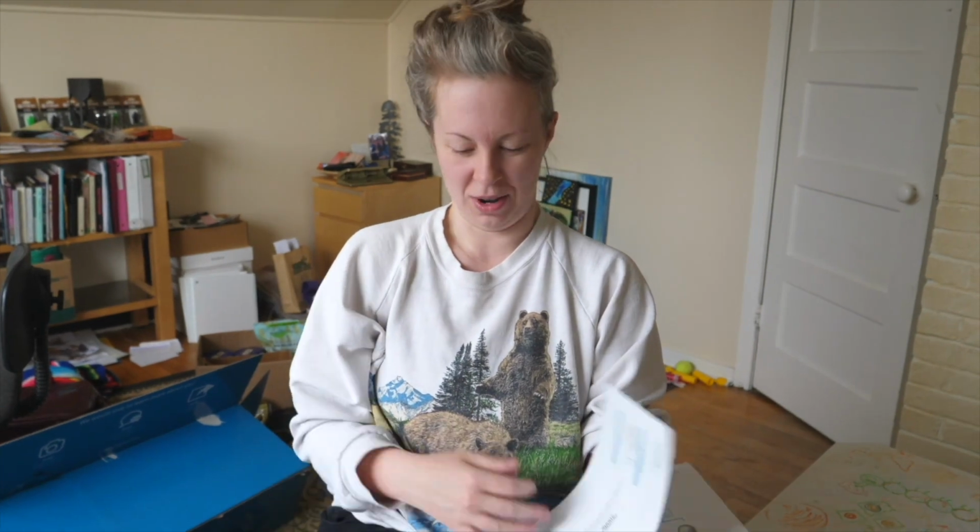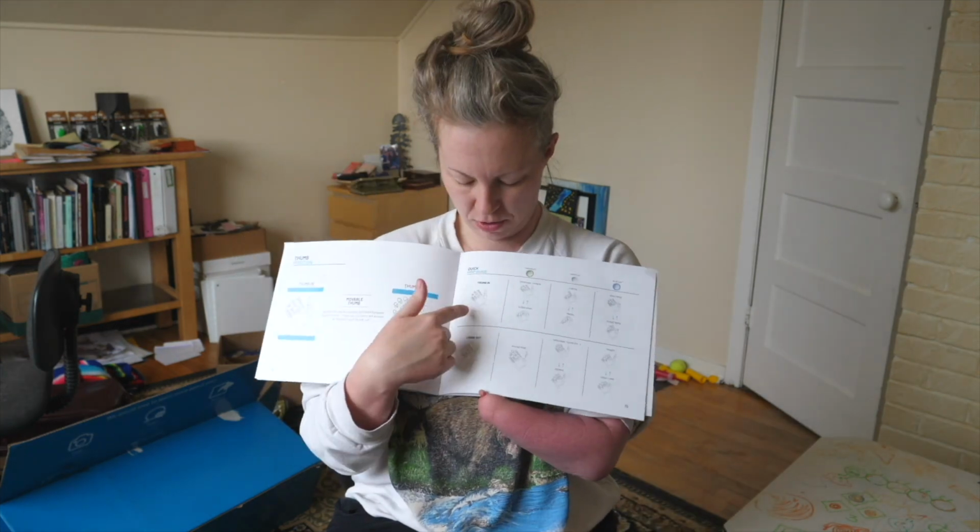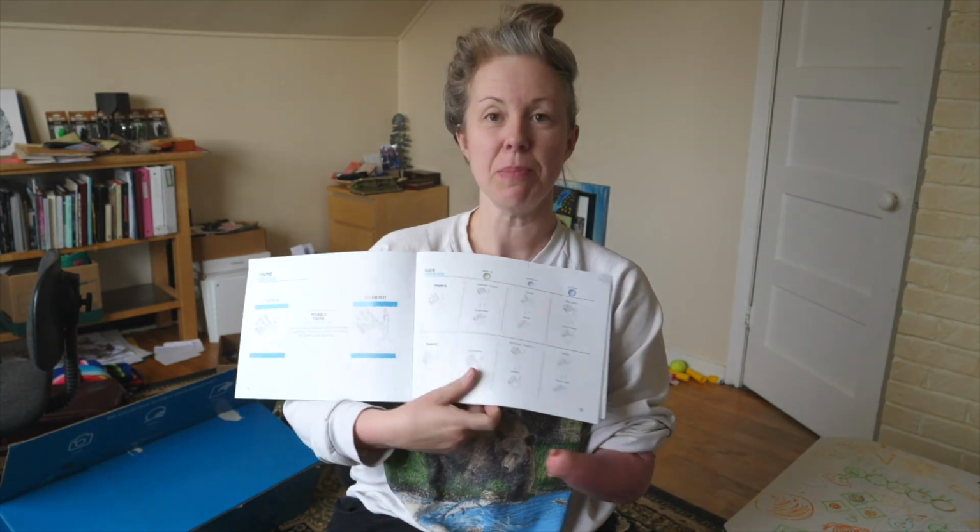So front and side. Whoa! Then there's like a thumb situation. So you can have the thumb pointing in like this, so it can do this, and then you can have the thumb going out. And then there's different instructions for what you do for each grip, and I have to learn them. I think it's like how you move your muscles on your stump. I don't know, it's exciting.